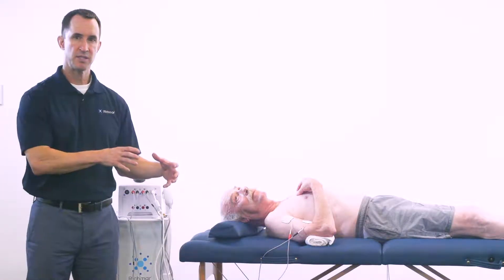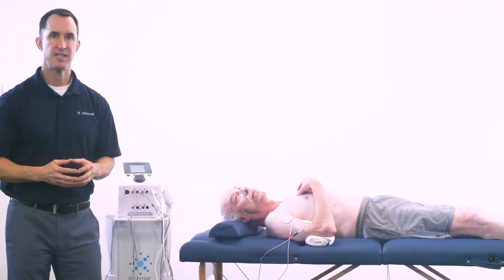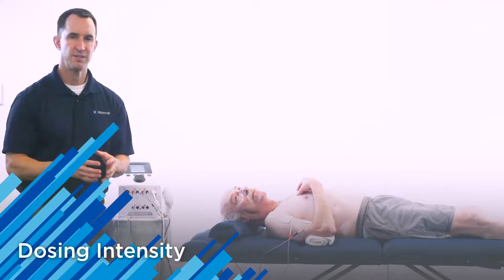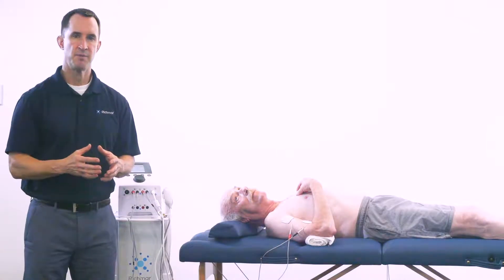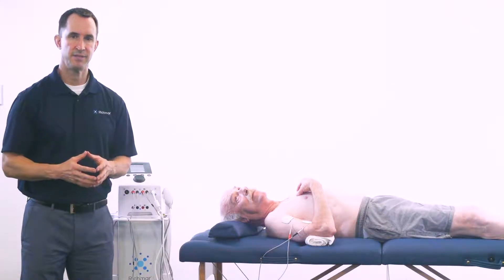The clinical example is hypertonicity in the biceps of a patient that is status post-stroke. The electrodes will be placed on the hypertonic biceps. When we talk about dosing of your intensity level, you want to increase the intensity to a tingling sensation that does not produce a muscle contraction or pain.